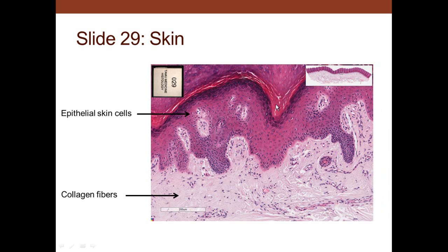Again, this is the epidermis, and you can see there's different layers. There's those on the base, there's the spinosum, granulosum, and then the stratum corneum at the top. These are different layers. Don't worry about identifying those now. Just to say all these are epithelial cells. They are produced in through here by mitosis, and then they differentiate as they go to the surface and finally are removed, sloughed off. The FBI are looking for those if they're looking for you.